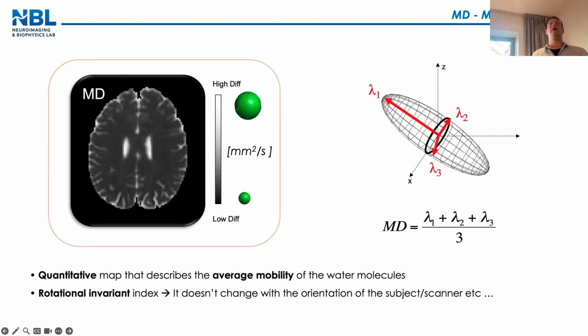Okay? And so we also said that ADC is basically the average, no? No. Yeah, that's, you have to complain with the clinician, not with me for that. Because in radiology, people call ADC the average of 3 ADCs. Because they do ADC on X, Y, Z, because they want to remove the artifact of anisotropy, and they just do the average ADC. So I know it's a bit confusing, but that's how we should call it: mean ADC, okay, to be technically precise.